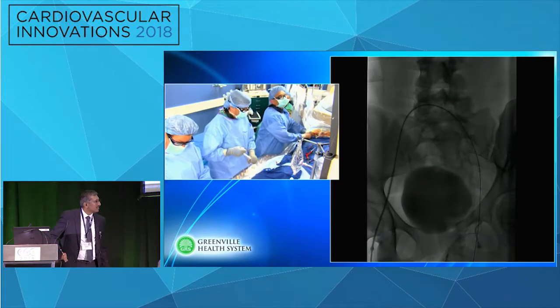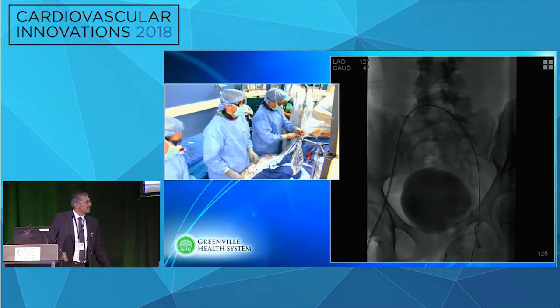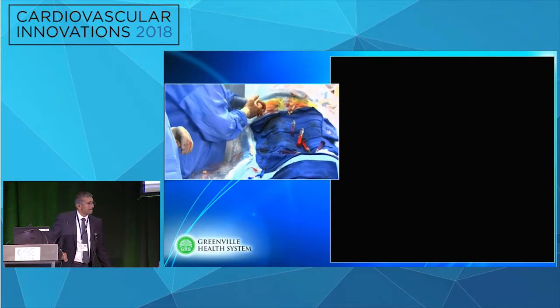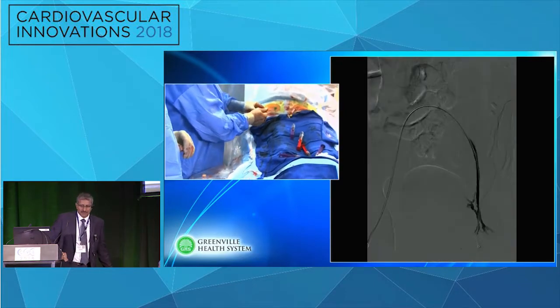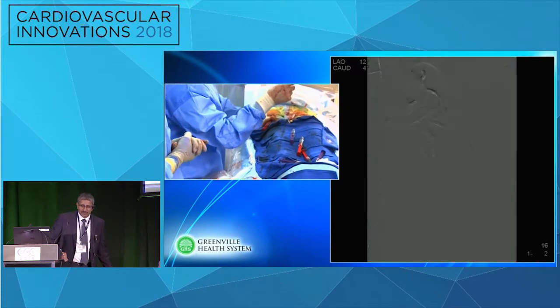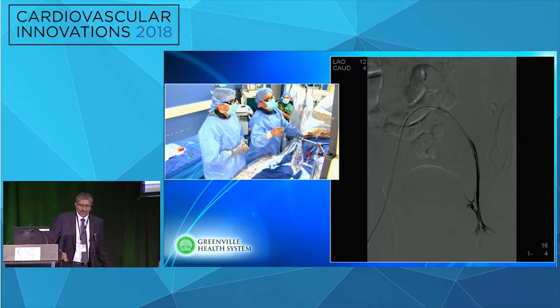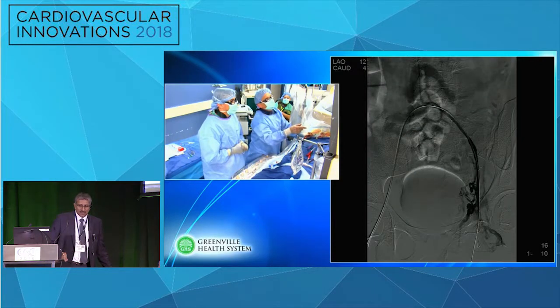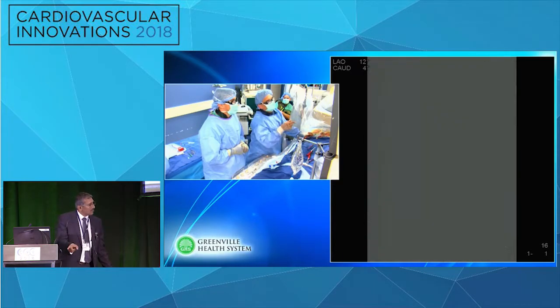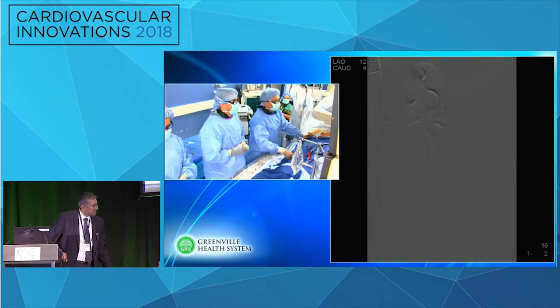Advance the balloon. Yeah, isn't the agreement now that it's better to go with a much larger balloon before you put a wall stent in? Oh yeah, no doubt about it. Before, I just wanted a balloon to show me. Now I feel convinced I'm in the right spot. If I did that with a 10mm balloon, which is what I want next, please, if I did that with a 10mm balloon to begin with and I was in the wrong place, I would have felt bad. And now you can see I like where I'm at better. The common femoral vein is now better, and that gives you a clear landing zone.